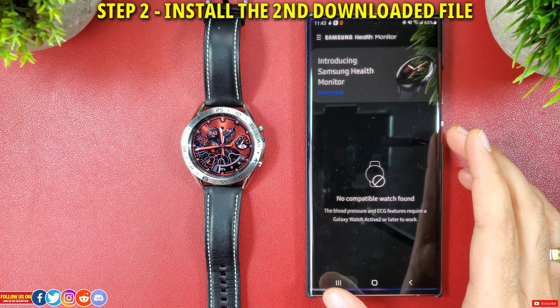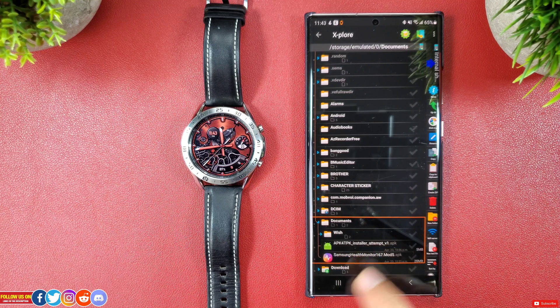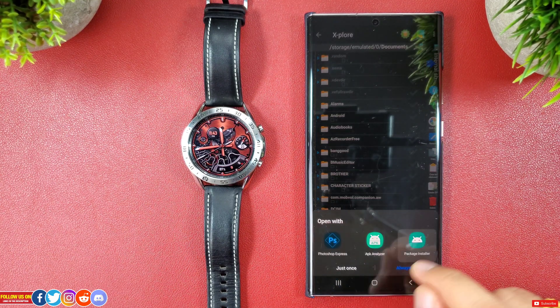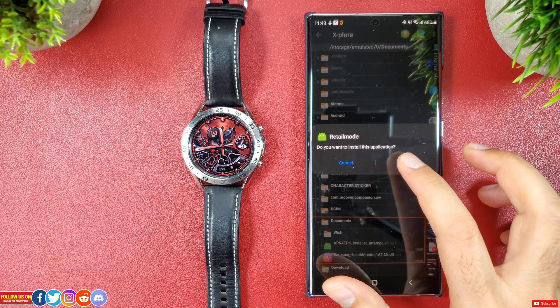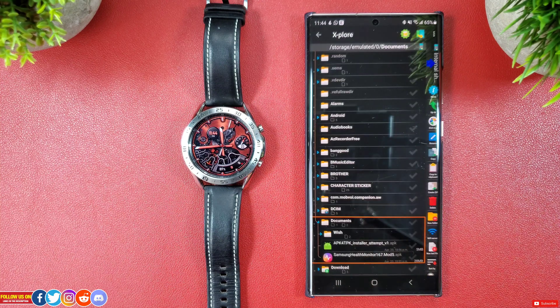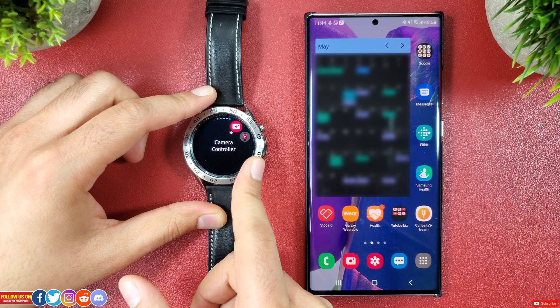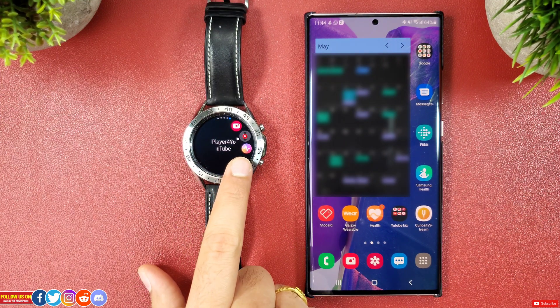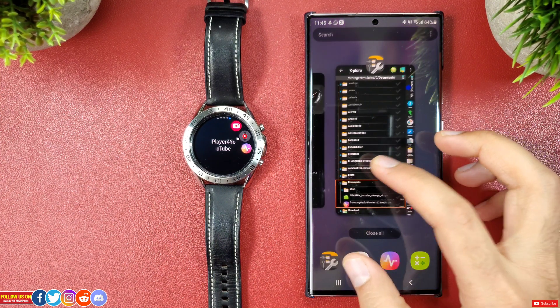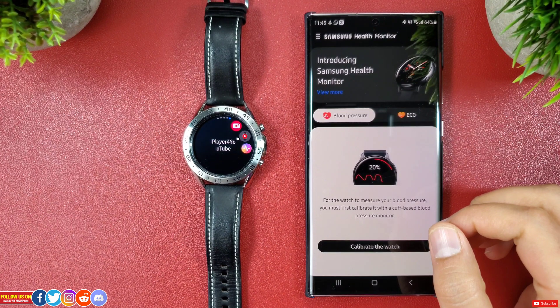Step number two: go to your file manager — in my case I'm using the Explorer — and go ahead and install the other file named apk4tpk installer temp.apk. Again you will get a popup about unknown sources, so go ahead and install it anyways and click done. After a few seconds you should see the Samsung Health Monitor app installed on your Galaxy Watch 3's menu, and when you go on the mobile Samsung Health Monitor app, instead of the previous no compatible watch found message, you will now be able to see blood pressure and ECG options.